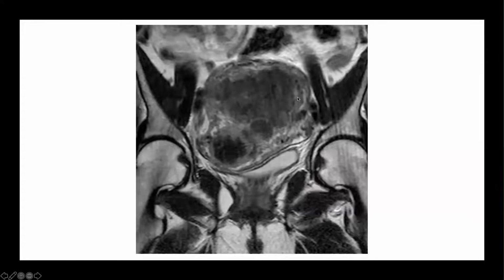And I just threw this in for good measure. So this is an MRI coronal view in a female patient who could well have been having belly pain due to degenerating fibroids. It's a large fibroid uterus, or bladder here. Okay, so MR is not usually the front line. CT and ultrasound are there, and out in A&E, a lot of plain films are done as well. So let me let in a few more.